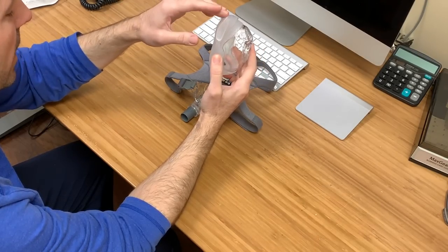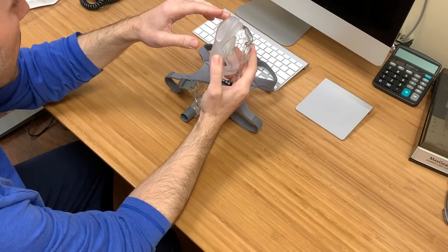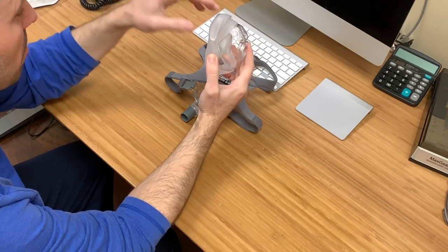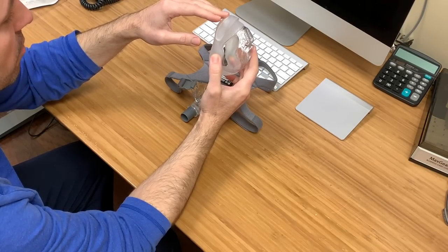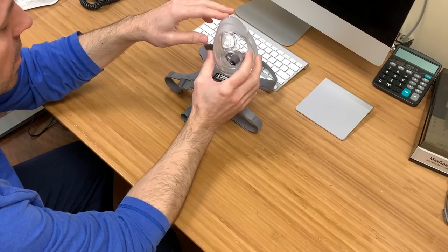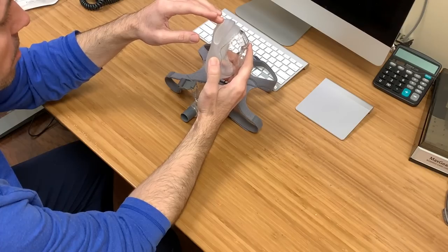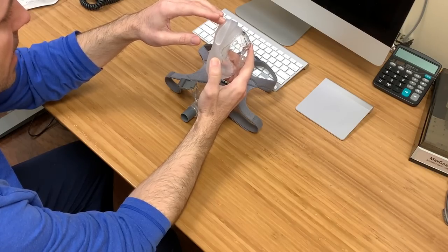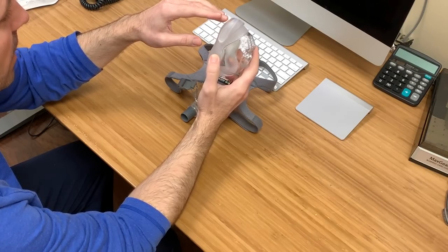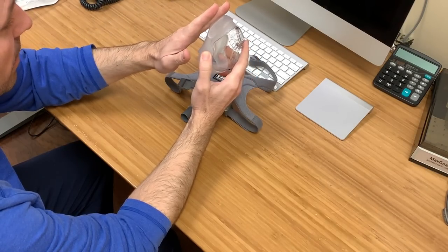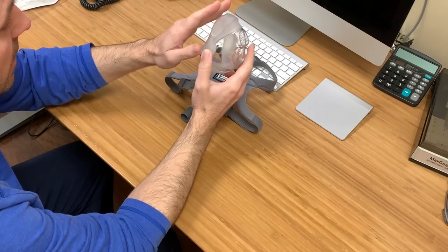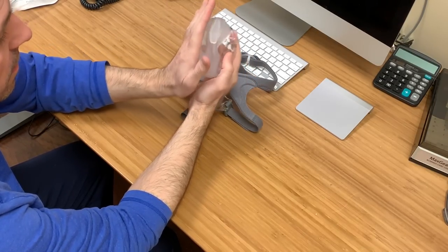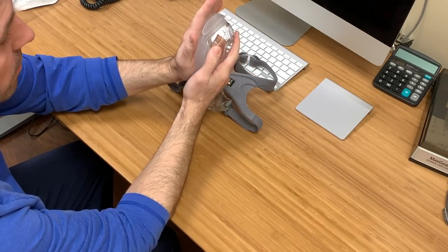So if you're like me who gets nose breakdown, skin breakdown, bleeding at the bridge of the nose, this is going to help alleviate that by putting less pressure on that by having that give. It also helps with the seal having that give too.